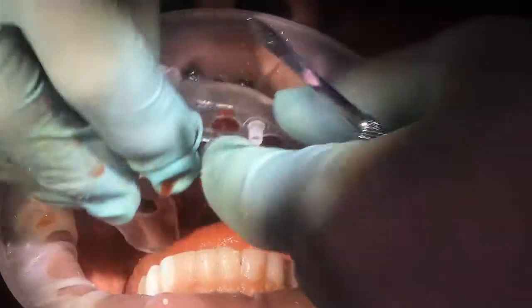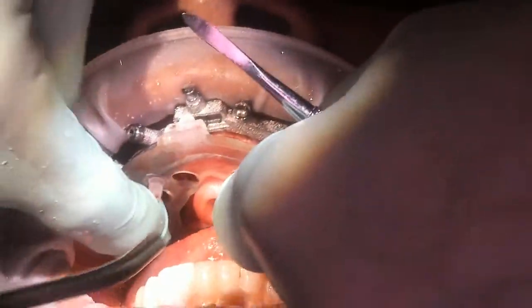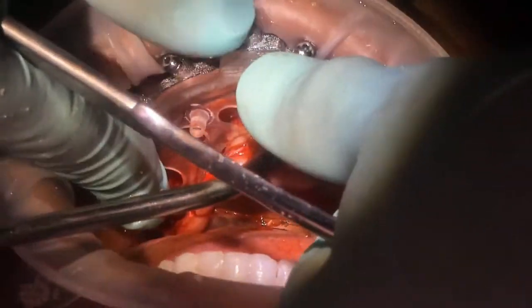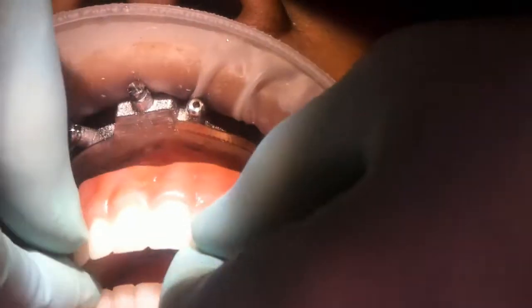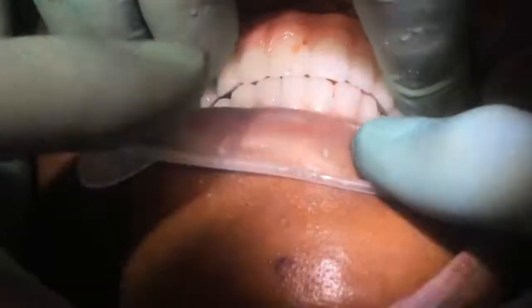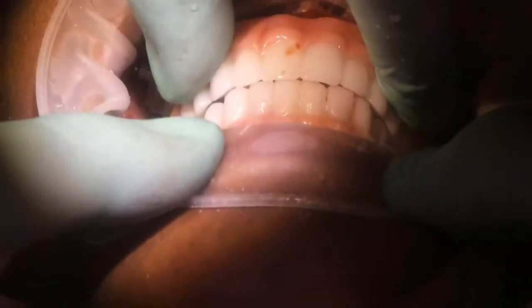And then this is a helpful trick that all of our chrome users, well, most of our chrome users use, which is to place the carrier guide and make sure that it seats and clips in gingerly. If it does, then you can place the prosthetic on and you can check occlusion in a single arch case, but in a double arch case, you can't really, because the opposing is going to be new teeth. In this case, they happen to just come together.